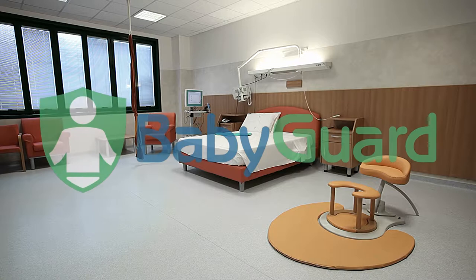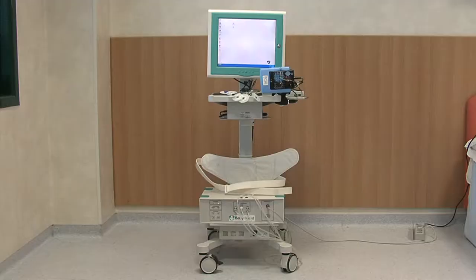BabyGuard è un dispositivo medico multifunzionale per la sicurezza del parto naturale, ad uso del medico e delle ostetriche.